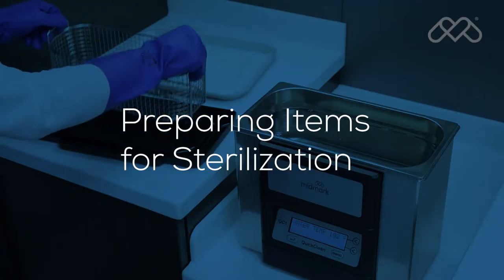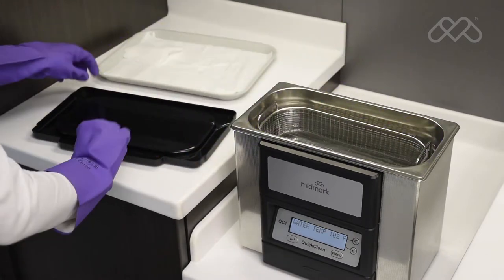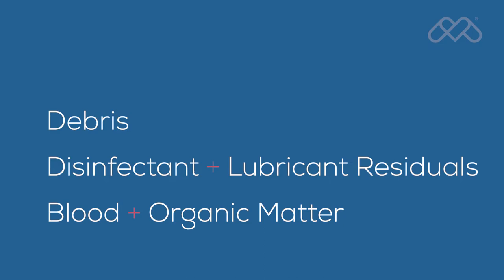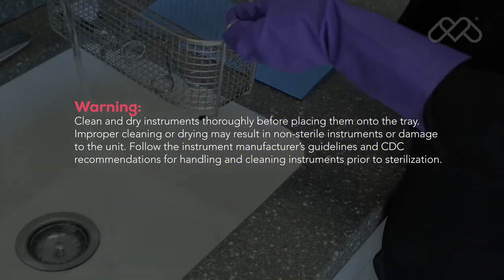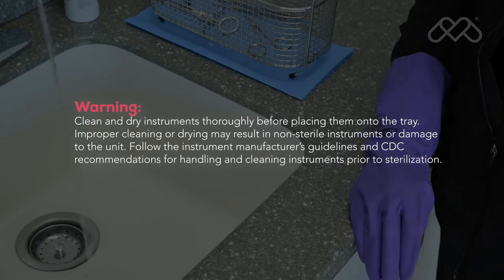Clean instruments immediately after use to avoid drying of residual matter. Instruments must be thoroughly cleaned to remove all residual matter, such as debris, disinfectant and lubricant residuals, blood, and organic matter. We are providing general cleaning guidelines, but the device manufacturer's instructions for proper cleaning and preparation of the items for sterilization should always be followed.